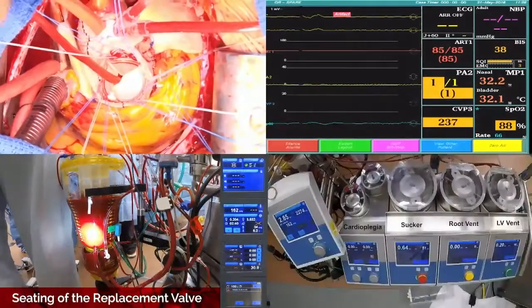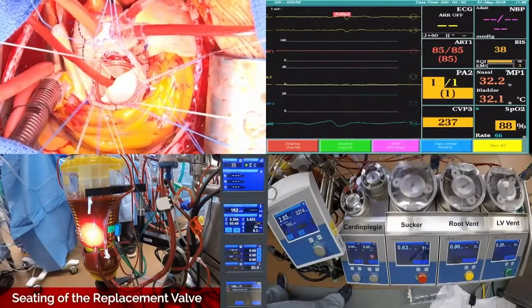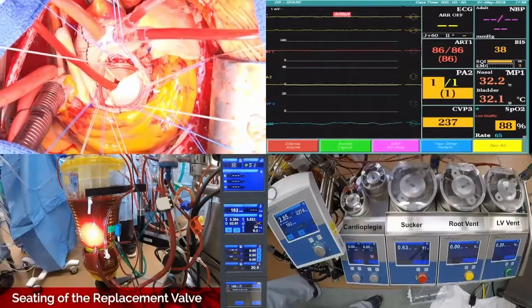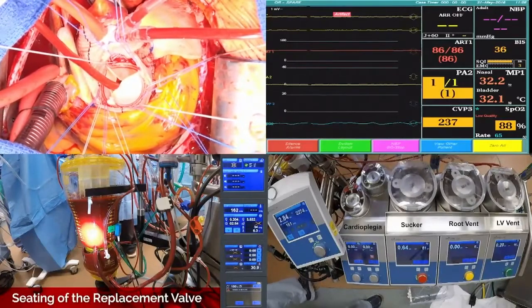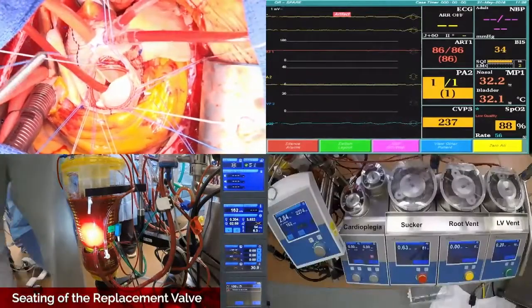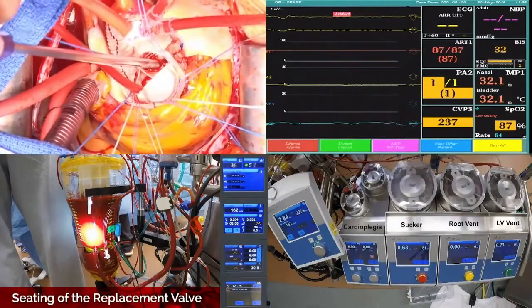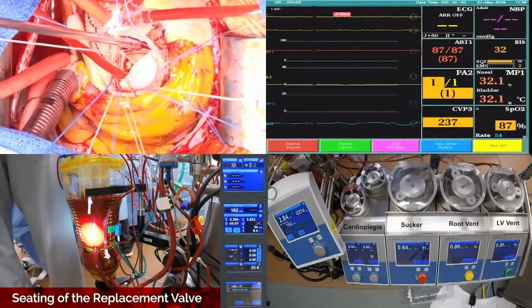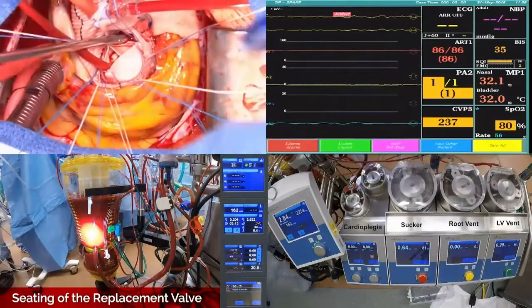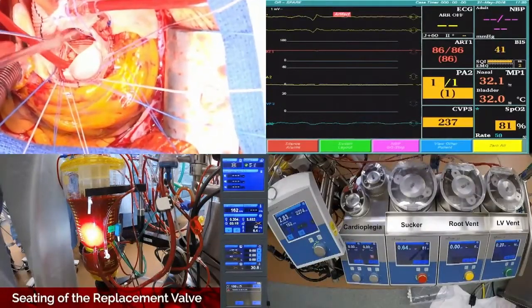And for us, for perfusion, it really posed a big problem because if we waited until you told us to warm, like we're at 32 degrees right now, if you look over there on that right panel, 32.2, with that core knot and you have 9 sutures there, we aren't going to get to 33 by the time you're done. But then you still have to close your aorta, so we have a little bit of time. And this patient was a small female, which buys us time. That's going to speed the process up too. If it's a 300 pounder, that's a real problem. Yeah, he's a large heat sink.